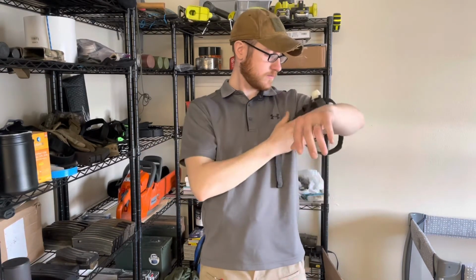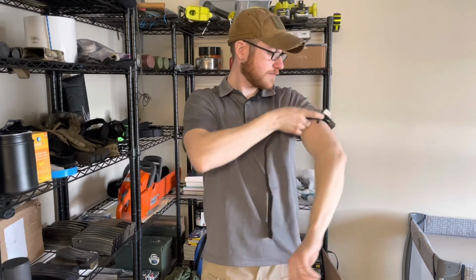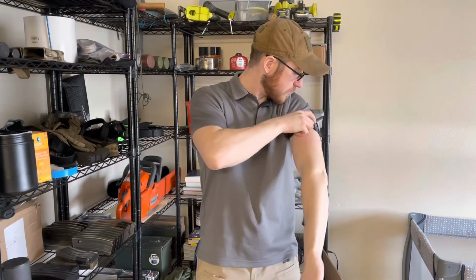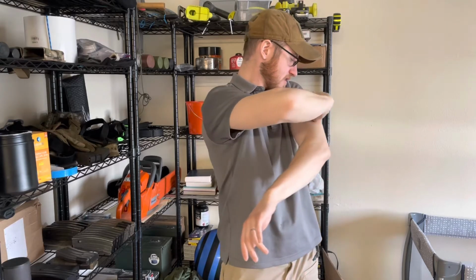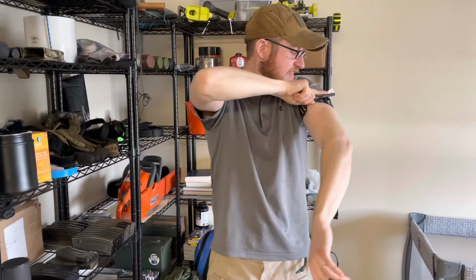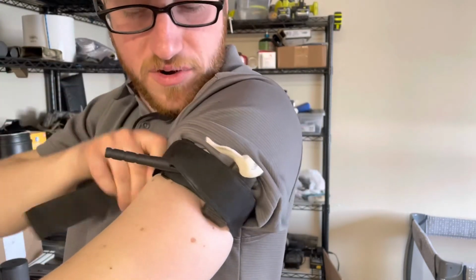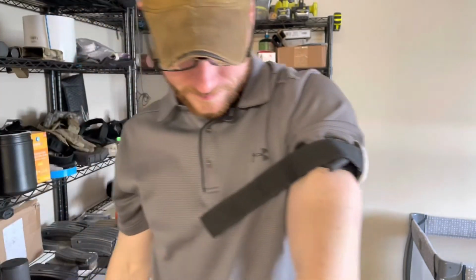Something to keep in mind with the arms. The arm is going to be a smaller artery, obviously, than the leg, and it will be a little easier to occlude the arm. And then you're going to get that occlusion, and then you need to push it over into the clip. Pull your Velcro over and secure it, and then secure everything in place.